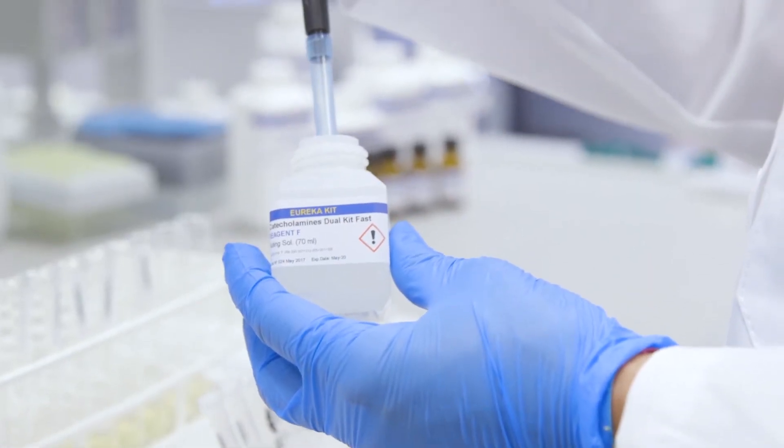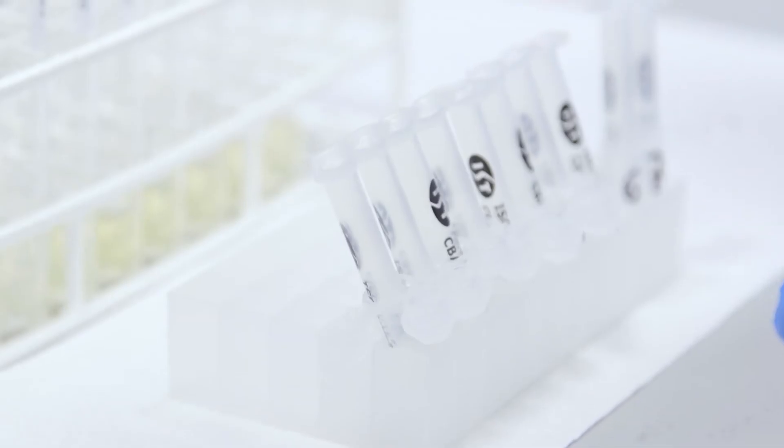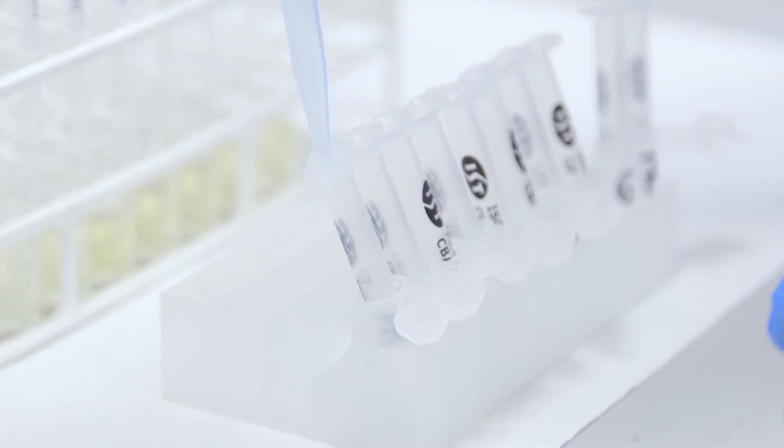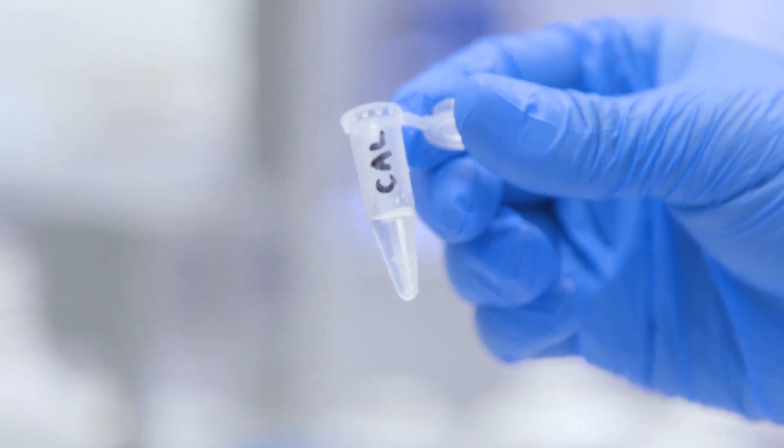Add 500 microliters of reagent F to each SPE column, taking care to collect the eluate. The elution should take place slowly for about 1 minute. Then the eluate is vortexed for 5 seconds.